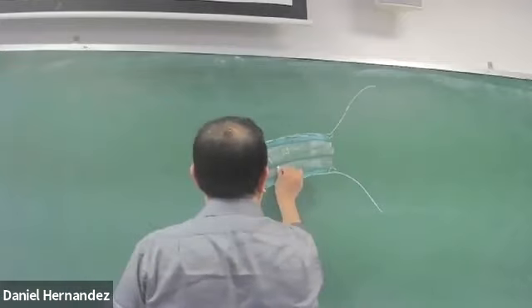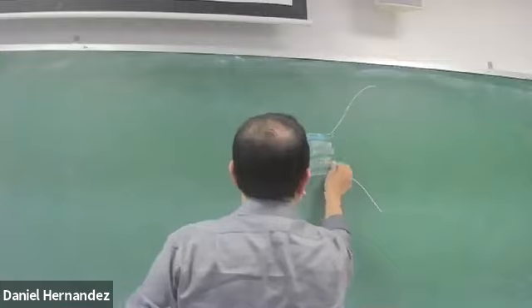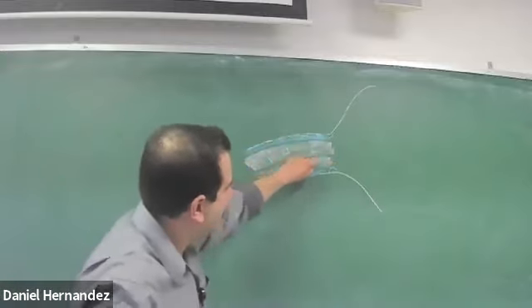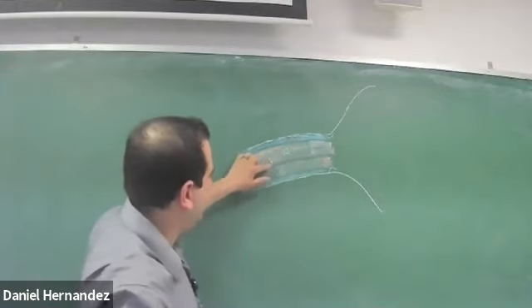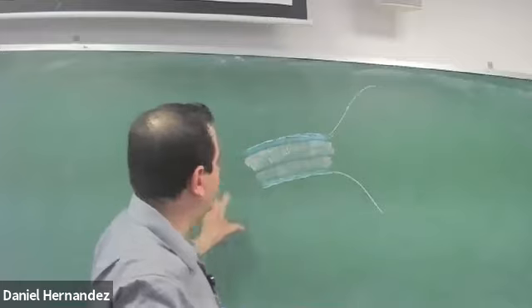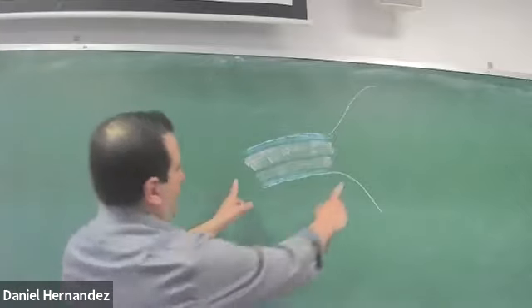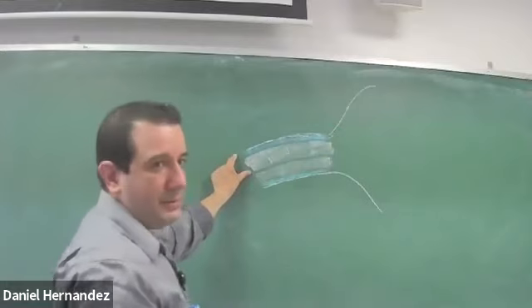So in cases where there is a hypertrophic pyloric stenosis, so I drew these two layers. So there's a small space in between these two layers. That's your actual pyloric channel. This is the pyloric muscle, which is now hypertrophied and grown. And when we're measuring this, we're going to measure the length of the channel as well as the muscle thickness.